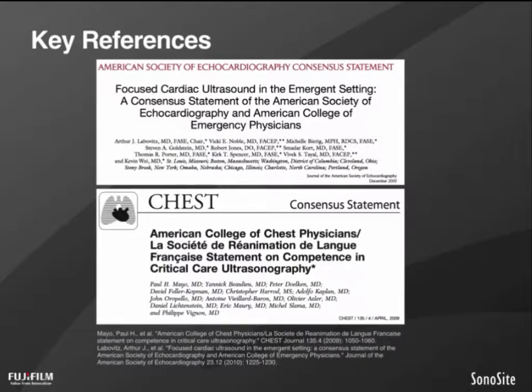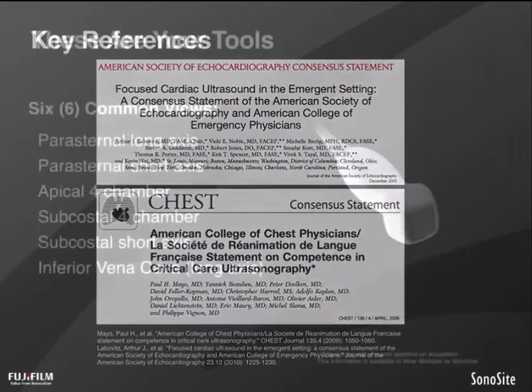So between these two papers, we have a pretty good idea of the topics that we should understand and know how to use at the bedside of sick patients, whether they appear in the emergency room or in the intensive care unit. And I would further submit that this can be extrapolated to any sick patient anywhere in the hospital.